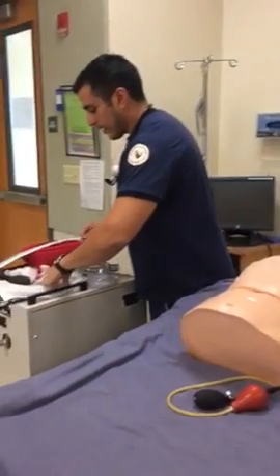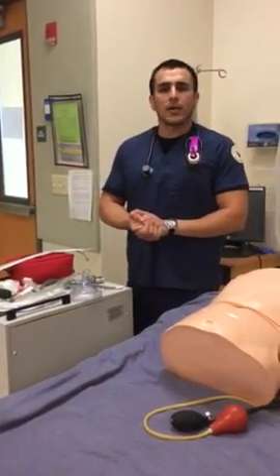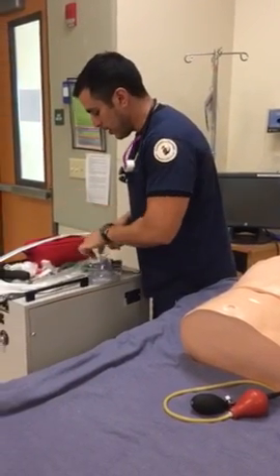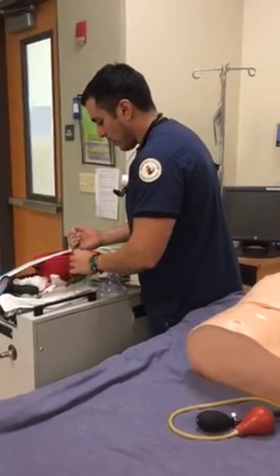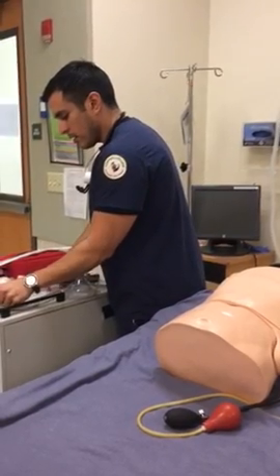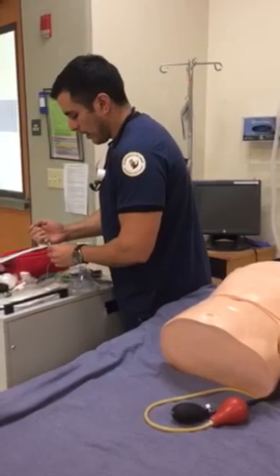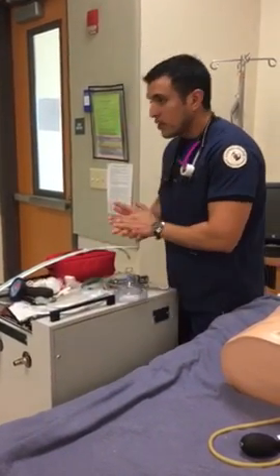We could also check the cuffs because most likely we would know what size tube we're going to be using in the patient, so we could already have our tube ready. We could put some air into the cuff and make sure that it holds pressure. And that's pretty much it for our checks.